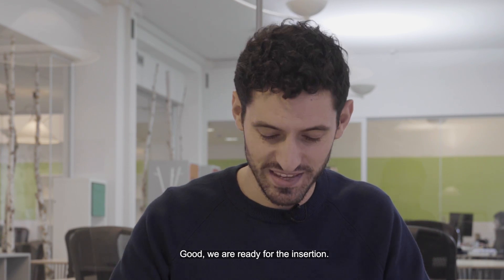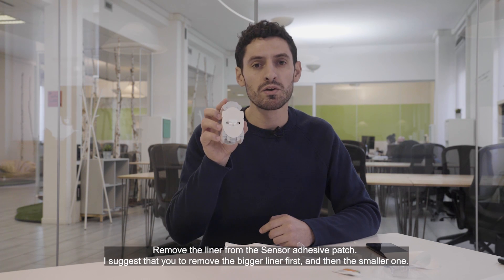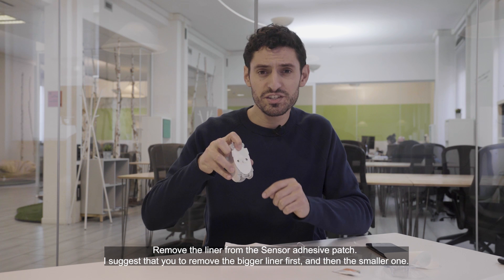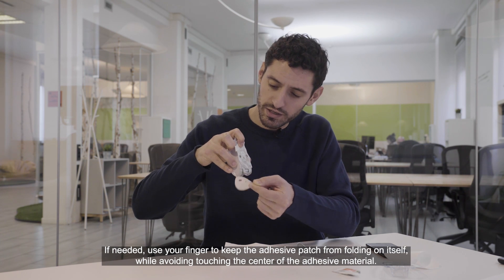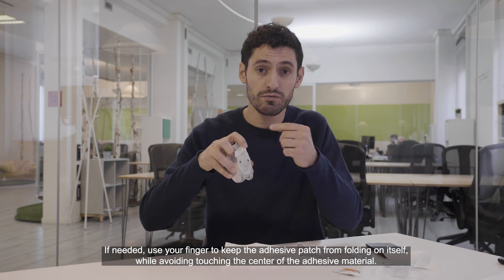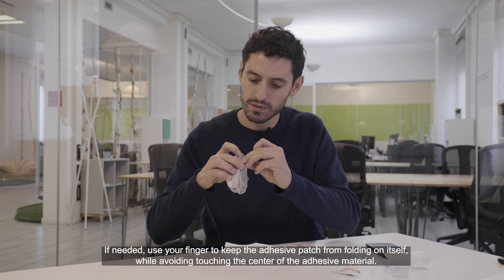We are ready for the insertion. Now that the site is totally dry we can insert the sensor. Remove the liner from the sensor adhesive patch. I suggest you remove the bigger liner first and then the smaller one. If needed, use your finger to keep the adhesive patch from folding on itself while avoiding touching the center of the adhesive material.